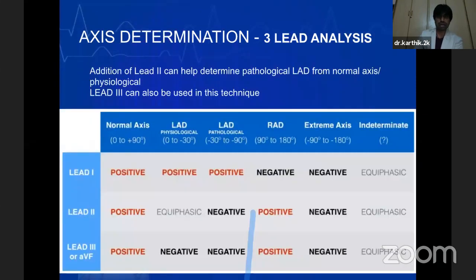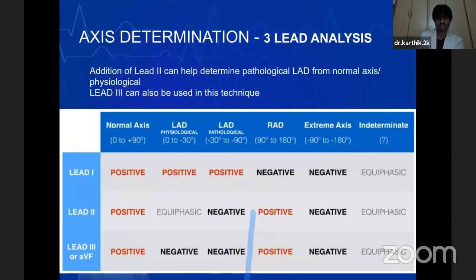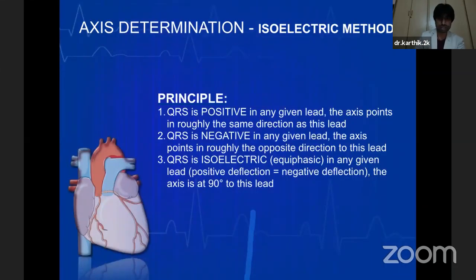Now we have additional axes. Sometimes this simple straightforward method may not be adequate, and you may fall into confusion at some point where you may have to bring in additional axes to get an overall idea. But this is quite complicated, and I would just skip this for now, because this would be beyond the scope of your understanding.